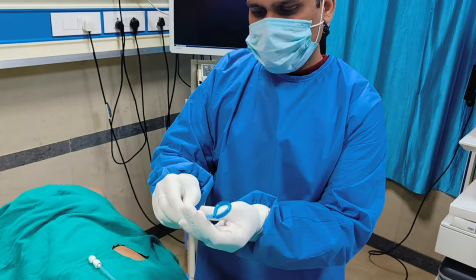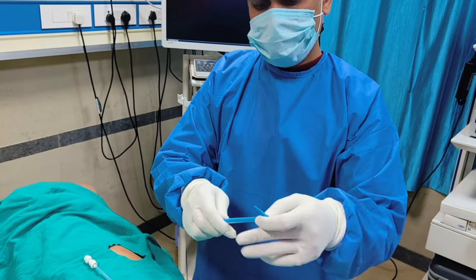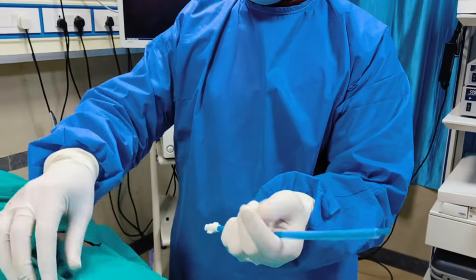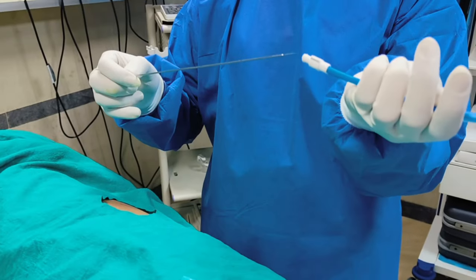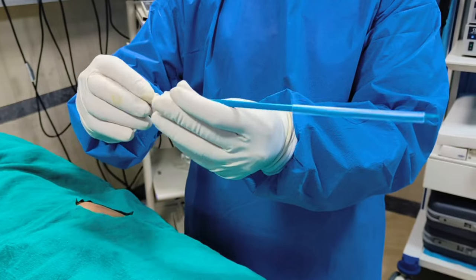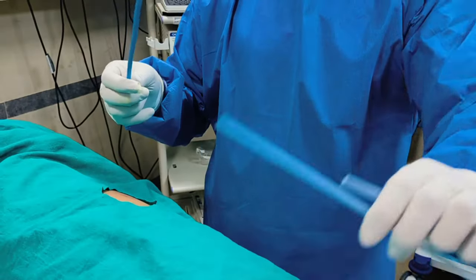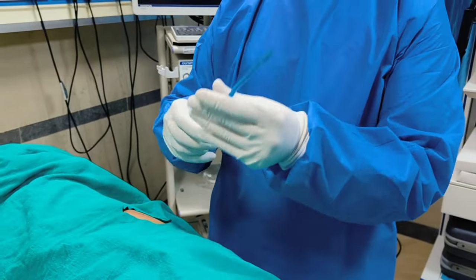We will now prepare our pigtail catheter. You can see the hole on the tail. We will straighten it using the hollow tube — this is the trocar, which is very sharp. Make sure not to injure yourself or your staff. We will tighten the screw and you can see this tip comes out. This tip is sufficient to pierce subcutaneous tissue, muscle, and pleura.